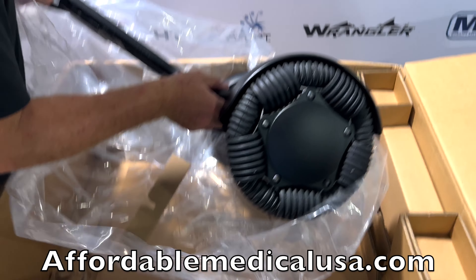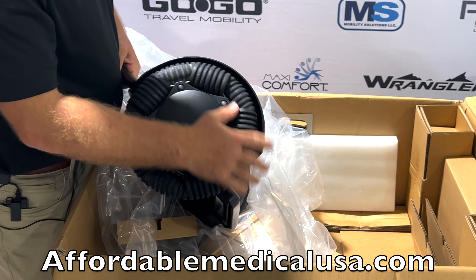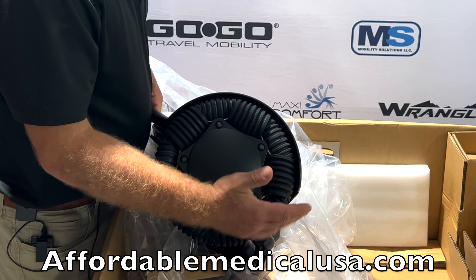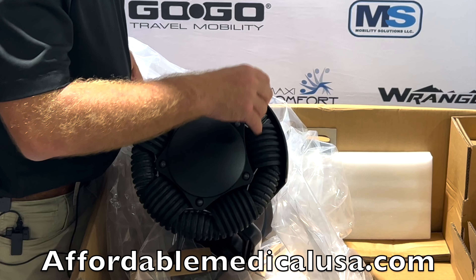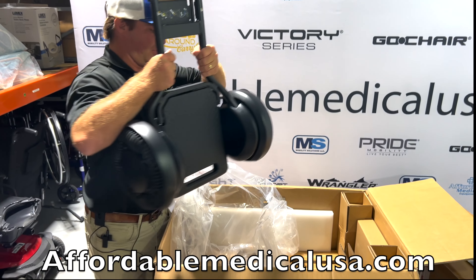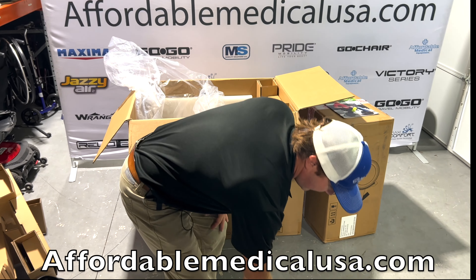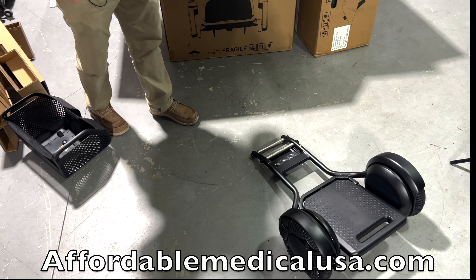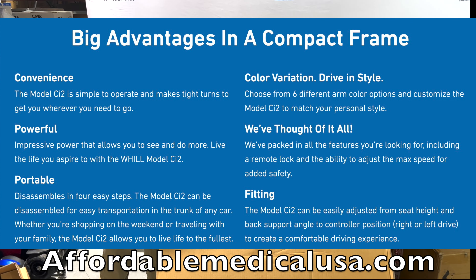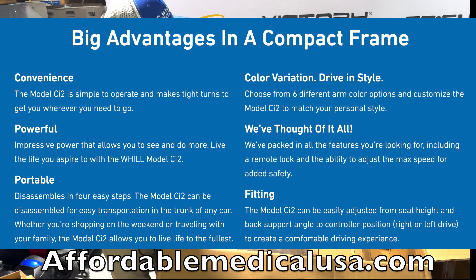This is the front end of the chair — these are your Opni wheels. They spin. The downfall I guess is if you're riding outside and it's real muddy, it can build up some mud and dirt in here, so I wouldn't suggest doing that too much. But it is capable of going through the yard and pretty much taking you anywhere you want to go. This would be airline friendly — you can take it on an airplane, bus, or cruise ship — and it comes with different seats to choose from.